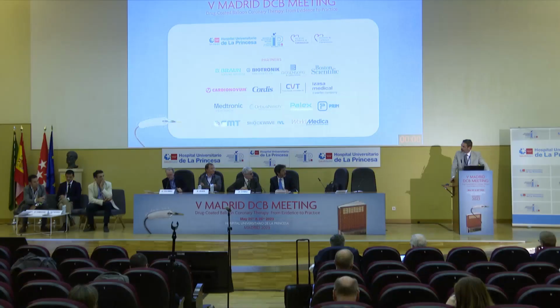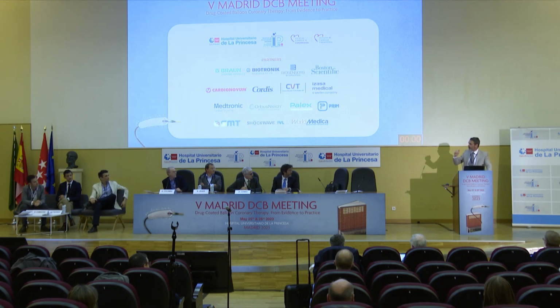Yeah. This is an important didactical point, so I would have replied to that question 1 and 2, because only 1 is not enough in my opinion. Just to assess in a single view the immediate result of DCB is not working. I remember a nice talk that I had after Patrick's meeting with Greg Stone. He told me that decades ago he did a study where they analyzed the recoil of POBA. But they analyzed it after the first minutes and then over time. After 10 minutes, after, I don't remember, 1 or 2 hours, and then after 1 month, 6 months, and so on. And what he said is very reassuring for us because he said that if you have recoil, in the vast majority of the cases, you have it immediately in the first minutes. So this is why you should wait 7 minutes, 8, well, I don't know why 7. Because it was 10, but then we reduced it because we always rush. So some minutes, and observe it in an orthogonal view. So this is what I strongly suggest.